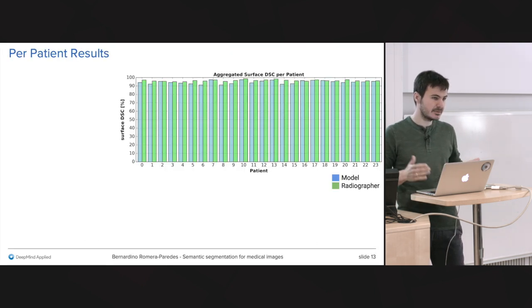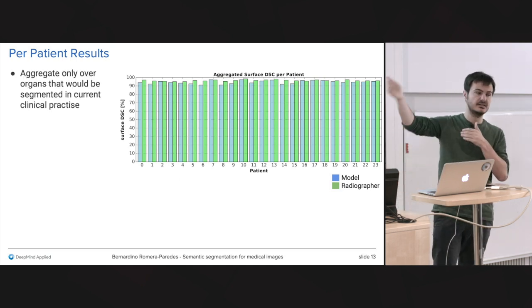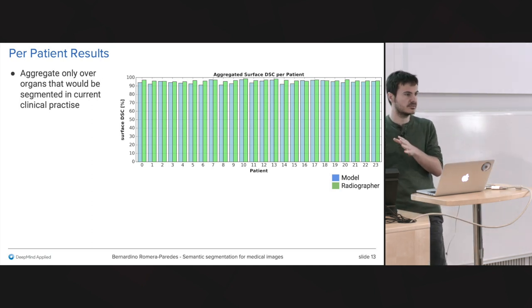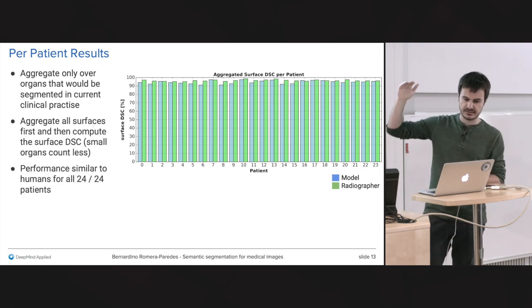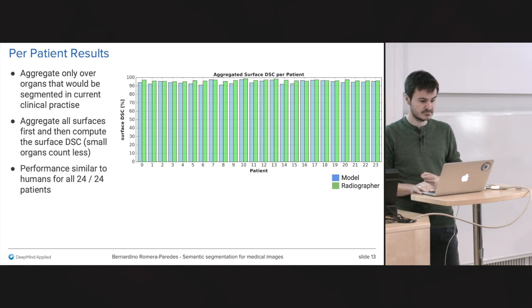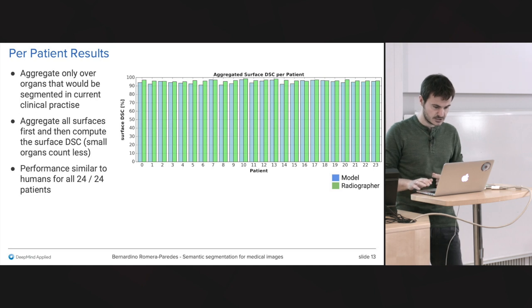And in terms of patients, as I said, we had 24 patients, and we aggregate the performance over the organs that are relevant for that patient. In general, we see that the performance is quite similar, not significantly worse than the radiographer performance. So yeah, in general, we're quite happy with the results.